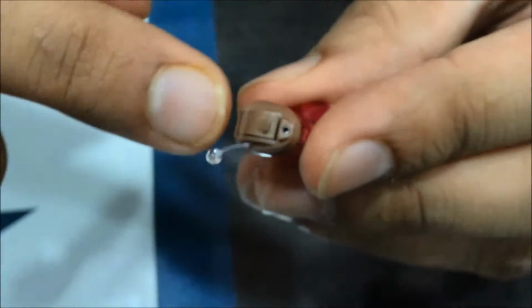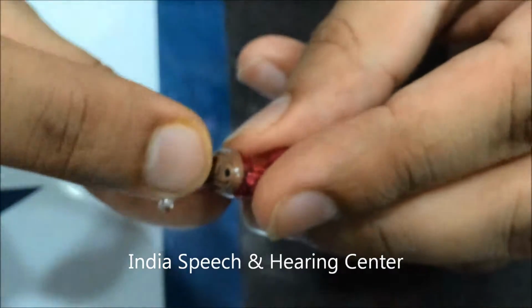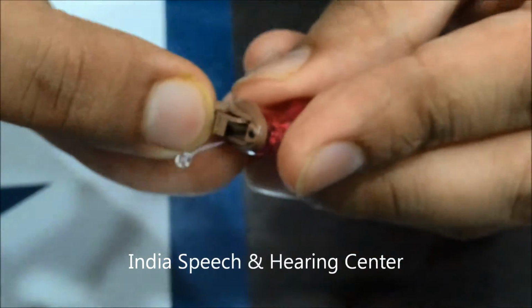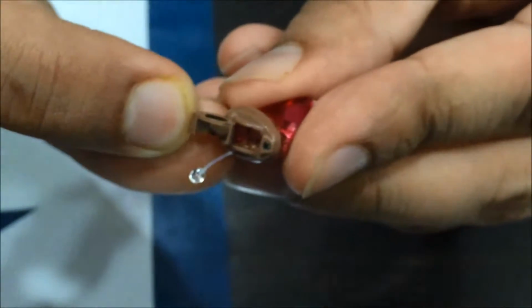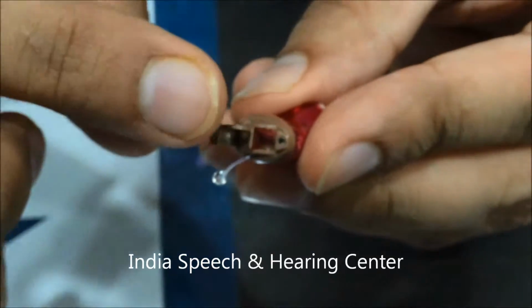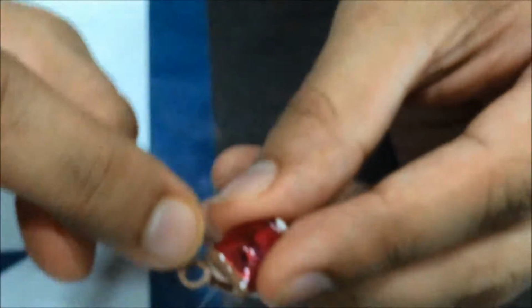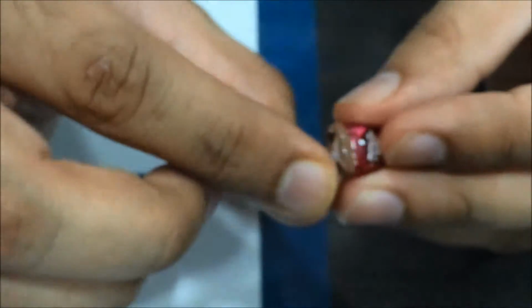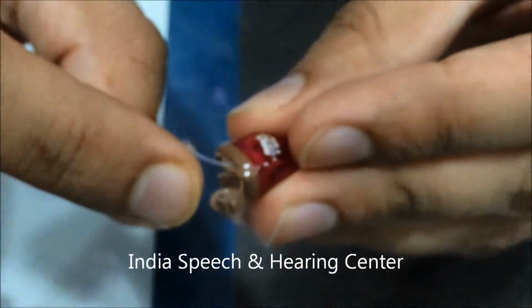If you see on the faceplate carefully, there is an upward loop. You can put your nail inside and open up this compartment, which is also known as the battery door, in an outward direction. This battery door has two ends. One is a circular end and one is open half semicircle.